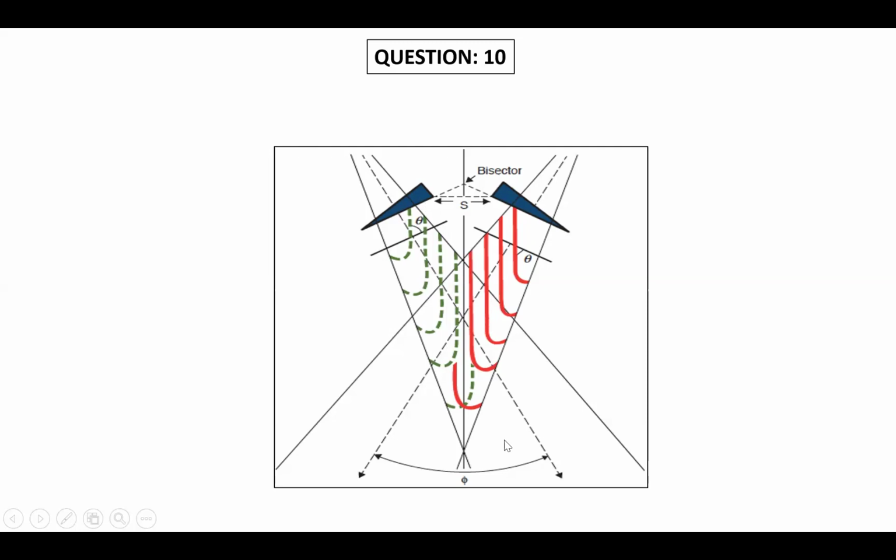Okay, sir. So if you have two beams, you have a tumor, patient body, you give two wedge beams. So which wedge angle you have to select, that is given by hinge angle. So that mostly it is not always right. If the patient is too irregular, it is wrong.